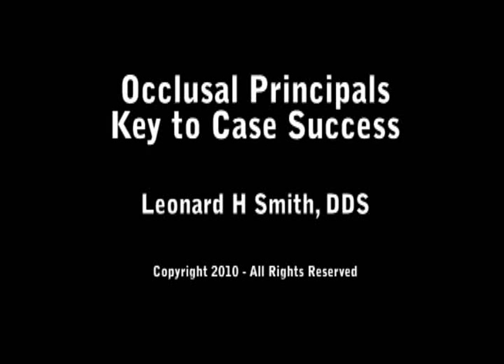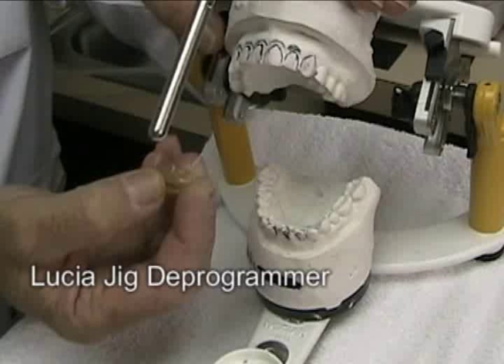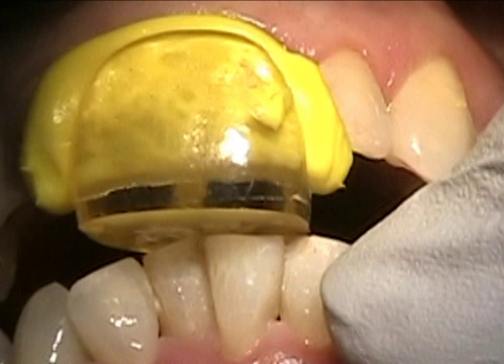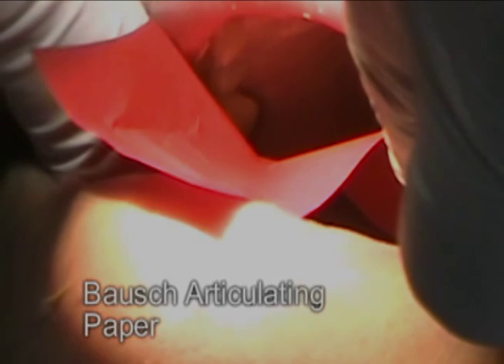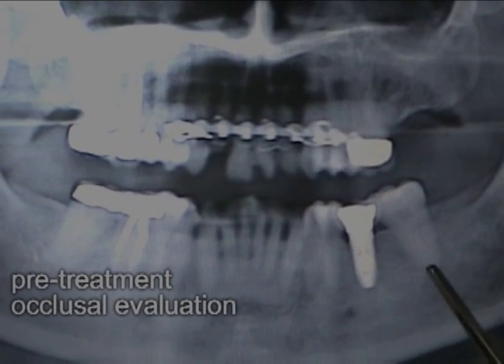This video will show mounting diagnostic casts on an articulator, then doing an occlusal analysis in preparation for presenting a treatment plan. It then shows using a Lucia jig to deprogram the muscles and using articulating paper to find first points of contact, and goes into the principles of equilibration. We're using oral conscious sedation with this patient.